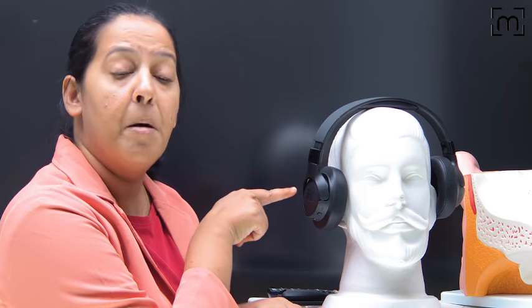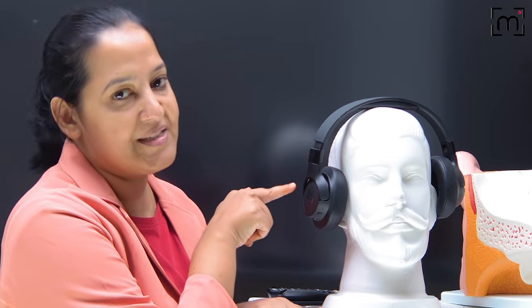In the pure tone audiometer, suppose I'm testing this ear, I deliver in this ear beeps of different frequency and different intensity. You know the frequency, you know the intensity. Intensity wise, I start with the highest, 100 decibel, and I reduce it at an interval of 5, and I ask the patient to tell me the minimum intensity at which 50% of the beeps are heard. That is taken as the threshold, known as the pure tone audiometry threshold. I told you the principles and steps. So this is pure tone audiometry.